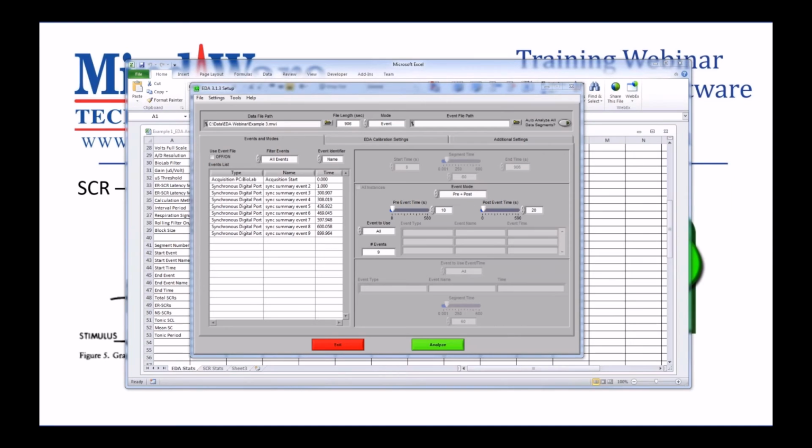All right, we've got another question about how respiration relates to a skin conductance response. So when you see an increase in respiration, there's a corresponding increase in sweat, which is going to be an increase in skin conductance. So if you see in your resp channel an increase in breathing, then you can consider the resulting skin conductance changes to be caused by or related to that increase in respiration.